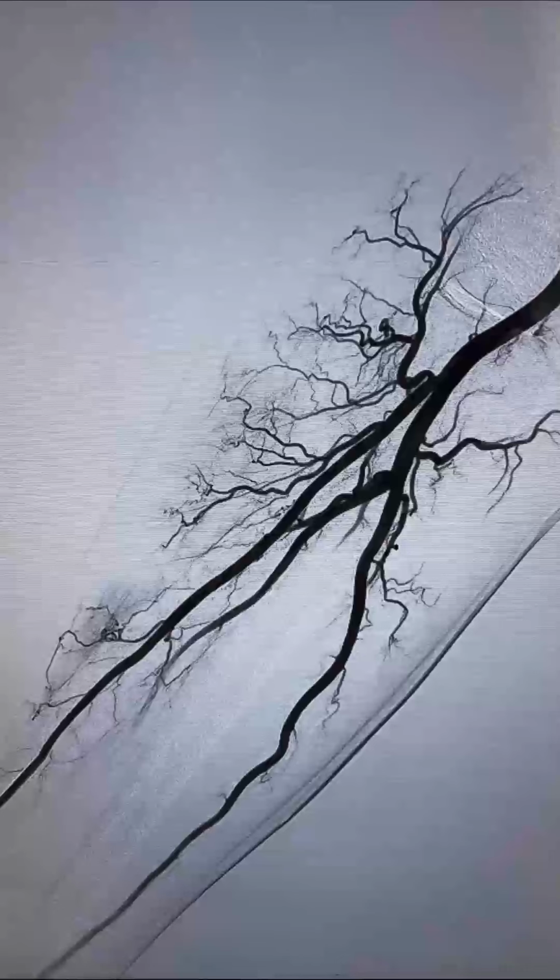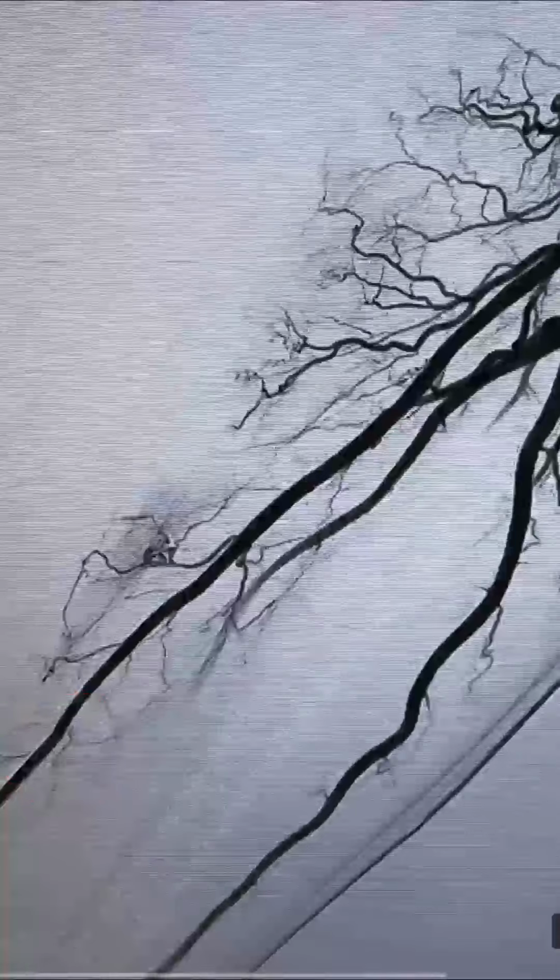You can see the sheath here. This is the sheath, end of the sheath. Now the catheter is taken and we'll go to the next picture. So what is this picture? What is this white image? Many times now we see this white image. This is called a road map image.